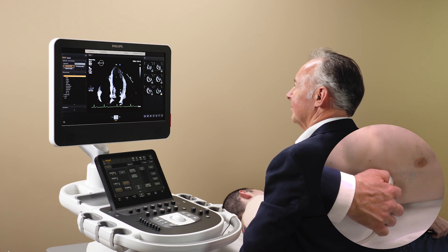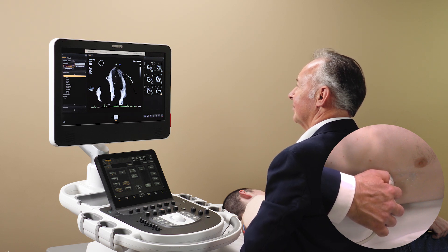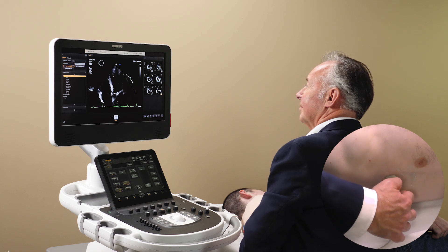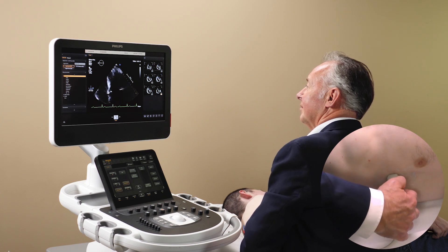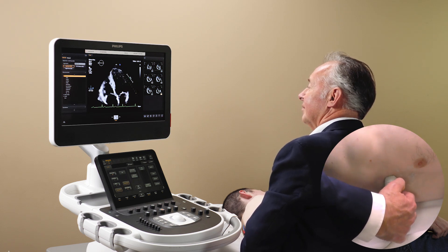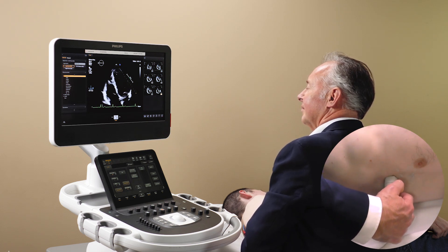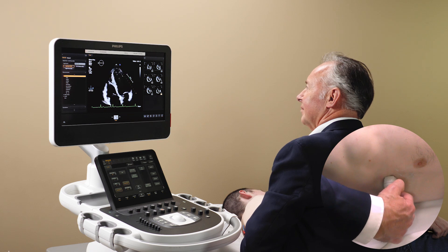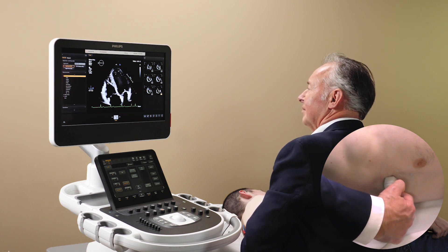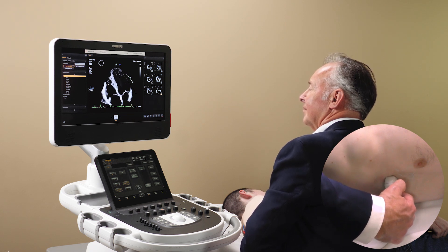Start from an apical 4-chamber view and slide the transducer to a more lateral position, keeping the left ventricular apex at the center of the image while displaying the largest basal RV diameter.